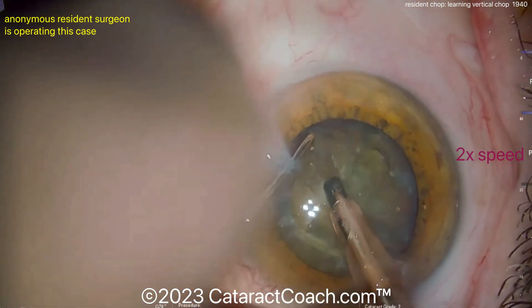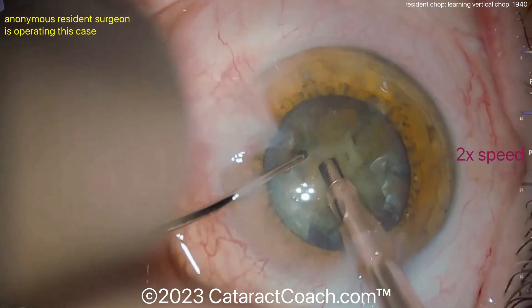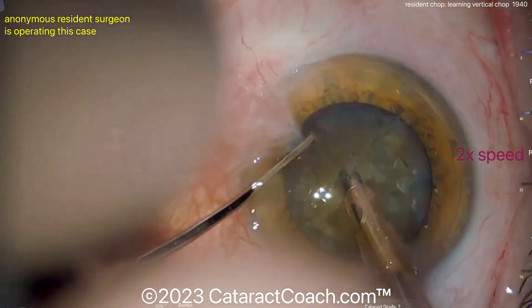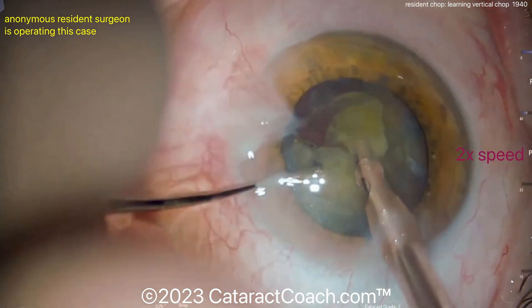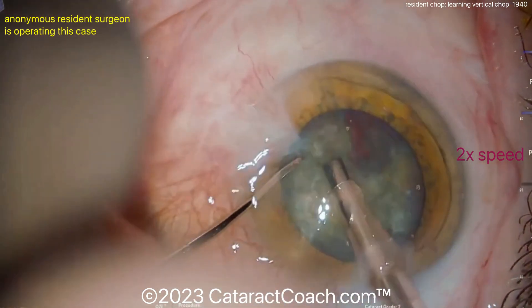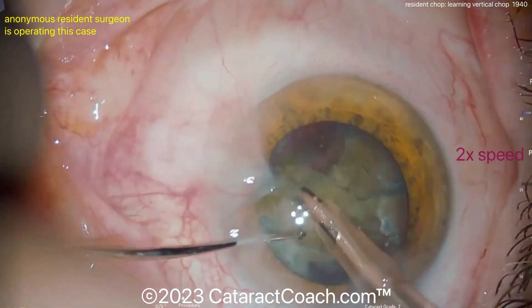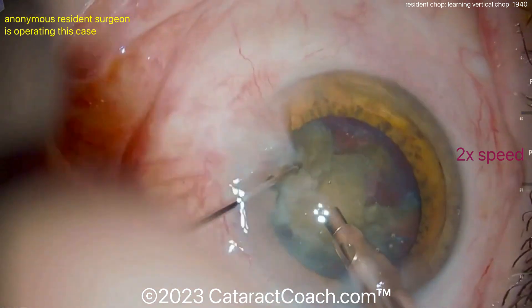This is the problem — this is why you're struggling and fighting it a little bit. All the chops are so tiny. You want the chop to be ideally the entire diameter of the nucleus. At a minimum, let your chop be a radius. These mini chops are at best half a radius of the nucleus, and that's just not going to be efficient — so many different chops are needed.